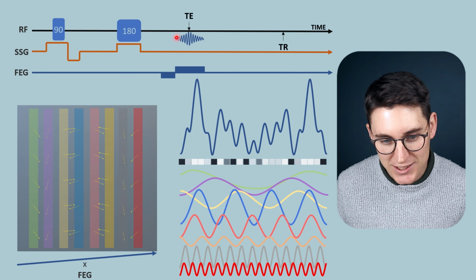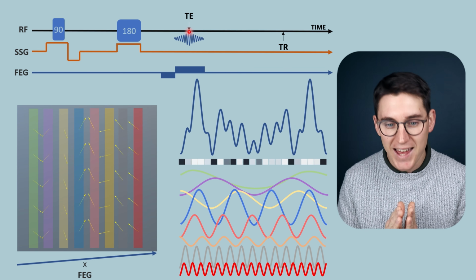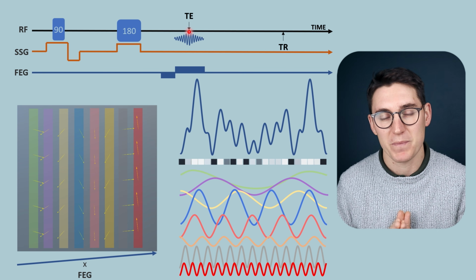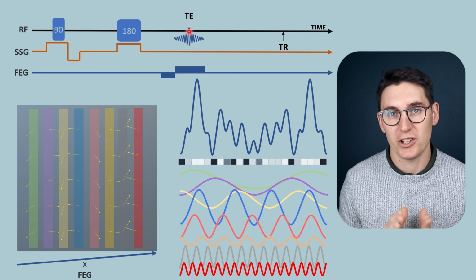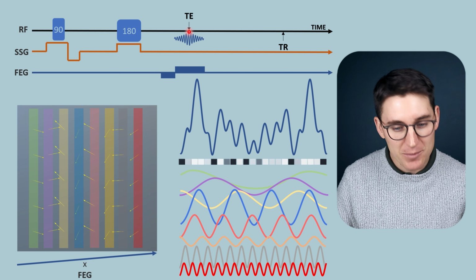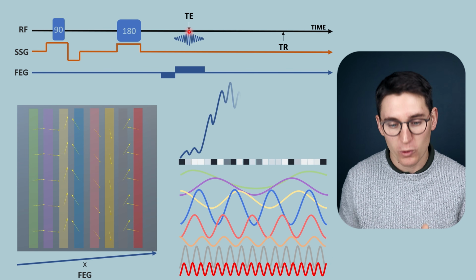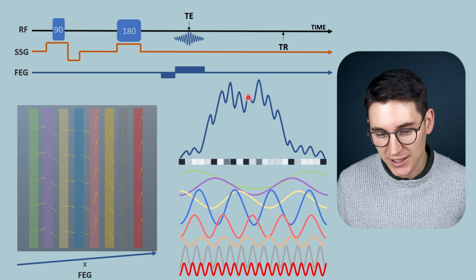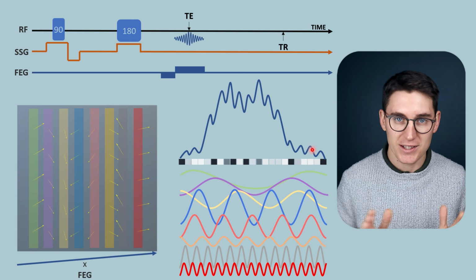Now, the increase in signal allows us to account for the local magnetic field inhomogeneities and get a signal at a TE that is much more similar to a true T2 decay. Now, if that is confusing to you, go back to the slice selection and the frequency encoding gradient talks. Now, because we get that increase and decrease in signal, the net magnetization vector that we read out from the slice is actually going to look a lot more like this, where we get an increase in signal up to TE and then a decrease in signal. That's occurring because of those rephasing within the slice.